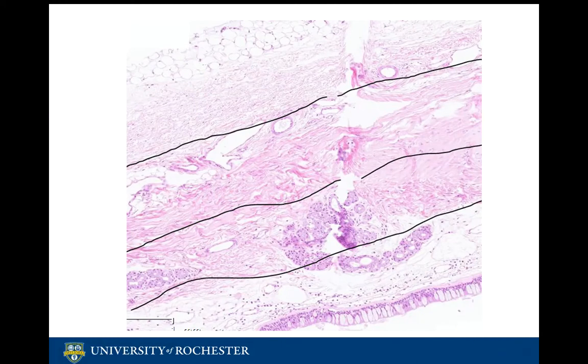Using the nano-zoom digital pathology slides available in the U of R Histology folder, we will examine the microscopic anatomy of the trachea. Feel free to locate slide 111 and follow along as we explore the trachea. As you can see in this slide, there are 4 main layers of the trachea. Each of them will be discussed in the following slides.